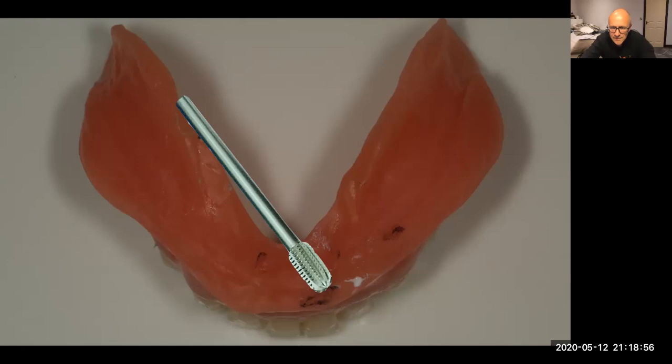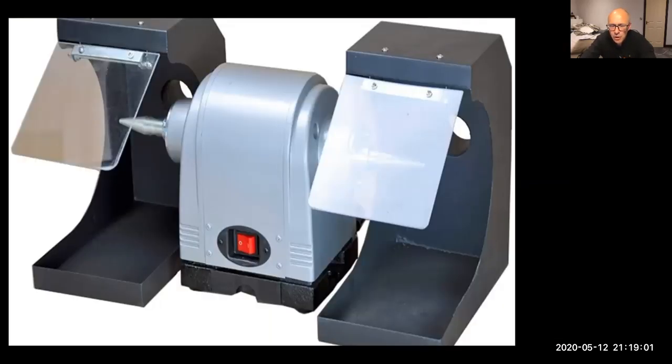But the other thing is, if you are really interested in doing a lot of prosthetic work in your practice, I would invest in one of these polishing machines so that you can have pumice and water on here with a polishing wheel, and then have a mop with the polishing paste on there. If you can have that outside of the surgery, you can just adjust the dentures and polish them up so they're just like new.